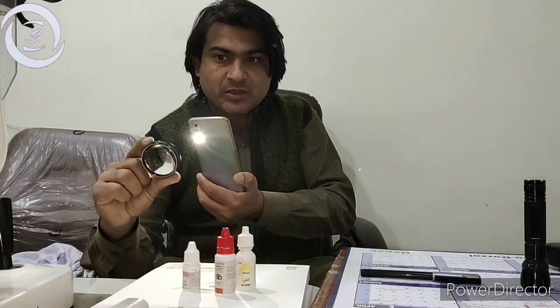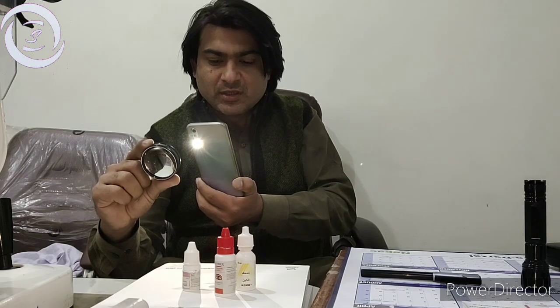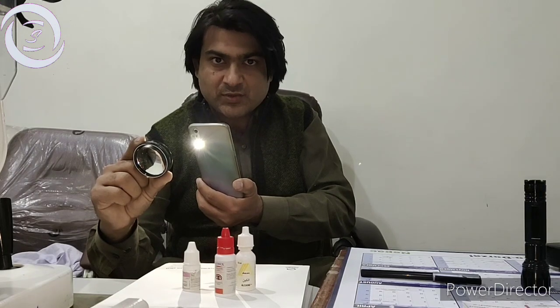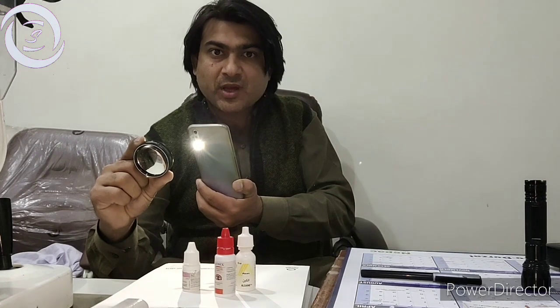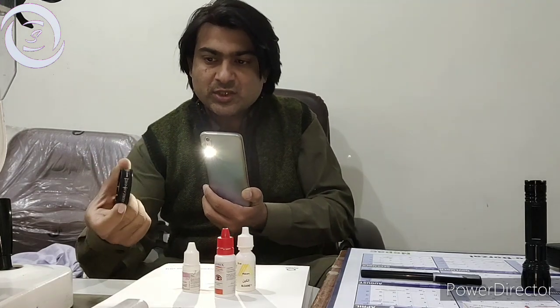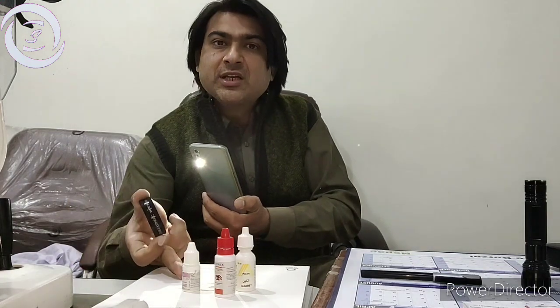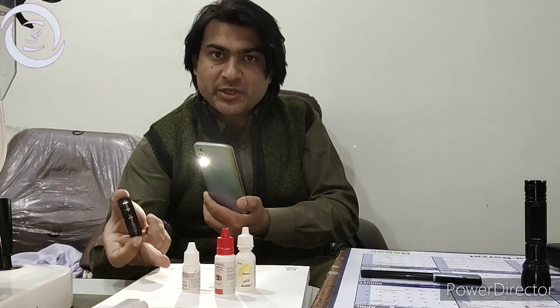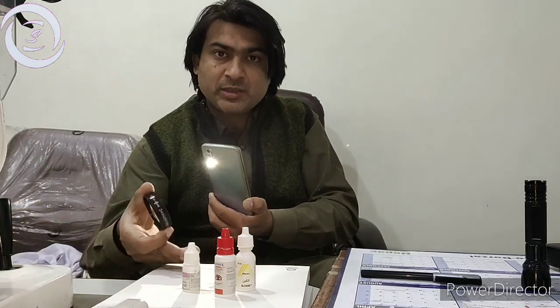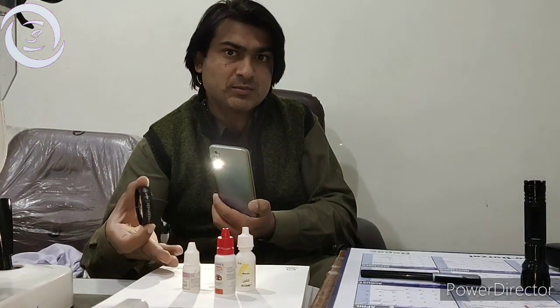Make sure you are well equipped and know the technique of indirect ophthalmoscopy well, because if you can focus the image with the indirect ophthalmoscope, only then will you be able to get the image on the 20 diopter lens. It's a very easy technique — you need a 20 diopter lens, a smartphone with flash on, dilating drops, and Alcaine drops, and you can get amazing videos and pictures of the fundus, reproducible anytime you want.